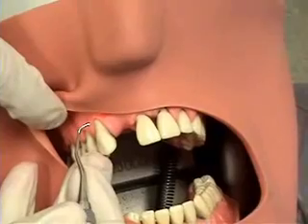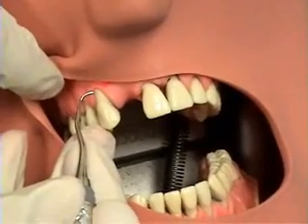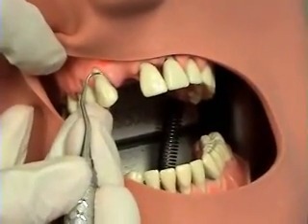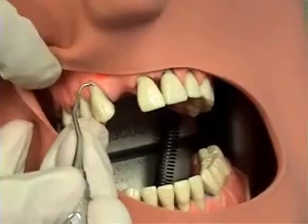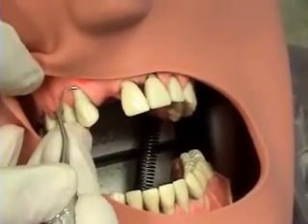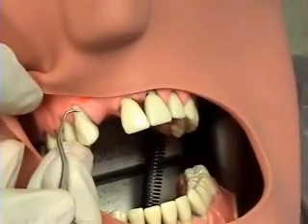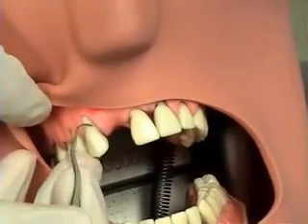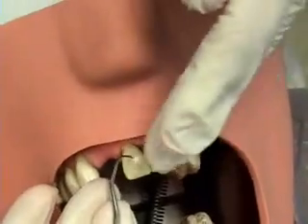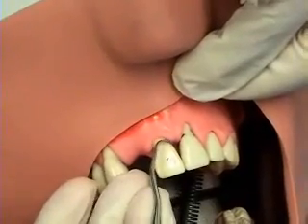This instrument is the Gracey 1-2. It is used for anterior teeth, both supra and subgingivally. The anterior teeth are divided into surfaces away and towards. Starting at tooth number 6, working surfaces away from me as a right-handed operator. You should never clearly see the face of the instrument, and the terminal shank should be parallel to the surface you're scaling. She keeps the toe one-third adapted and uses a rocking or rolling arm motion for the strokes after exerting lateral pressure.